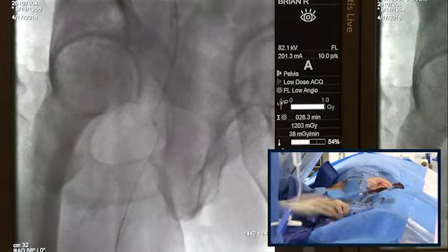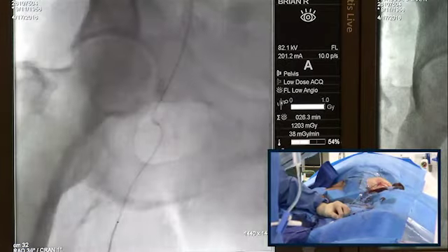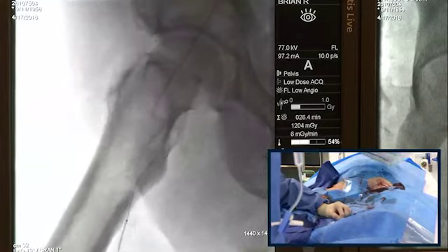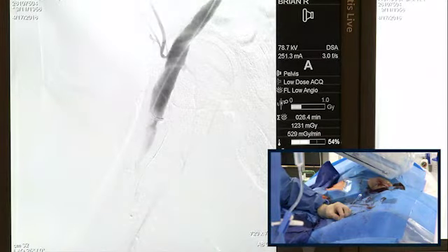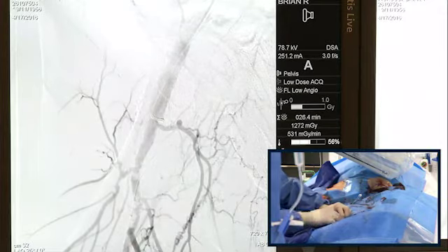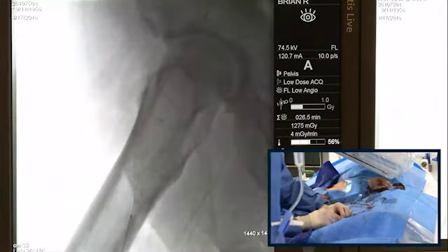let me see here in this view. Let me check in the other view. Do a little test here. Let's see. One second. I think that looks good. I agree. That looks like the stump, or at least what we think is a stump. Right.